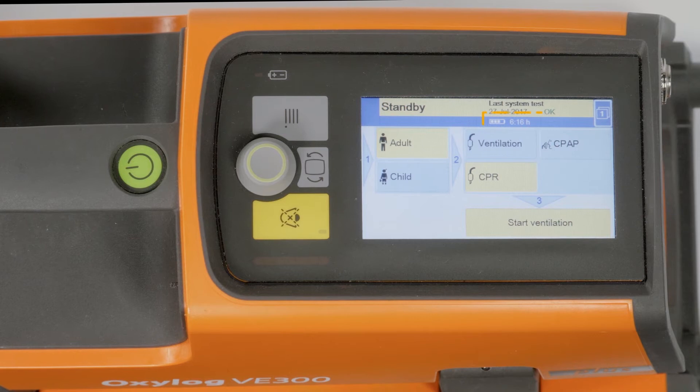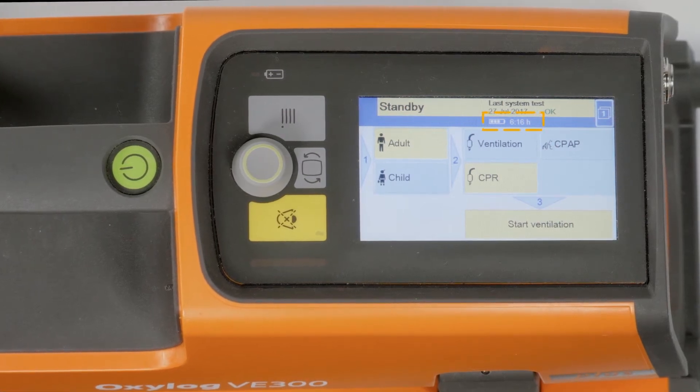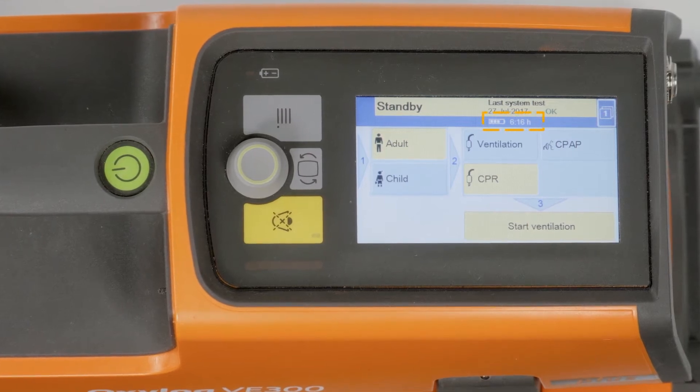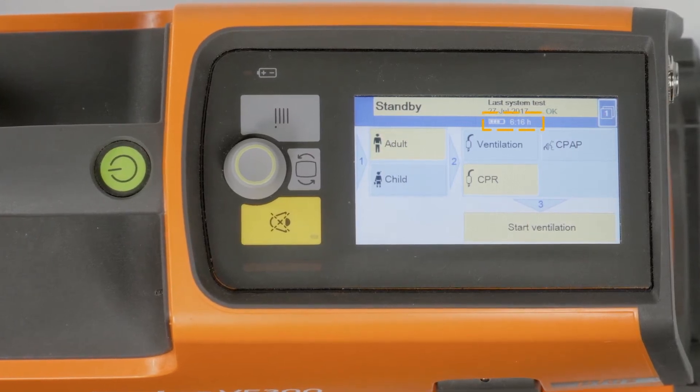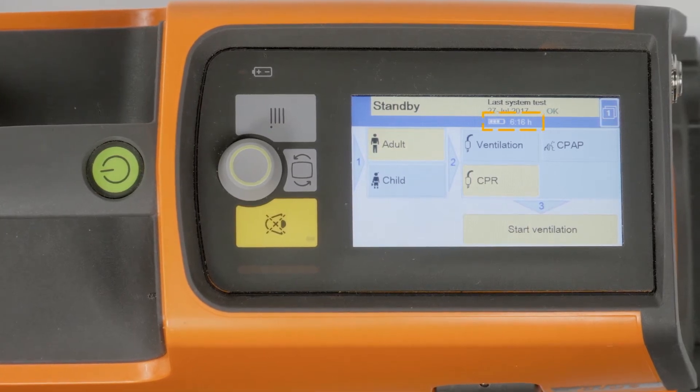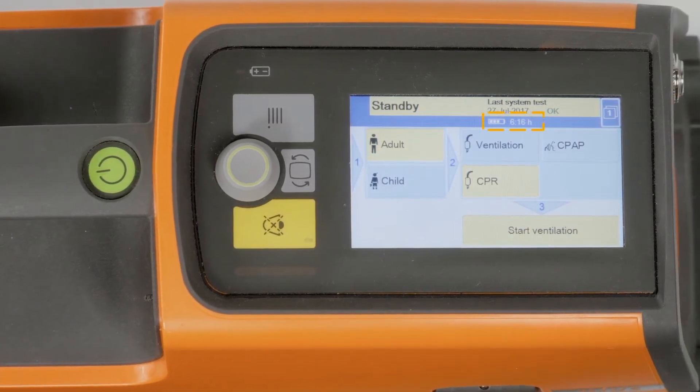When the device is switched on, the remaining battery charge is displayed in the header bar below the oxygen mode as a symbol in increments of 25%. In addition, the remaining duration of operation in hours and minutes is displayed. The numeric display appears on start-up after a short delay.